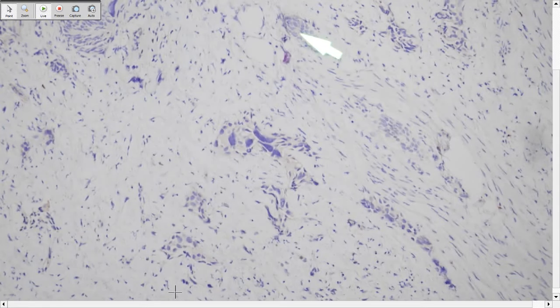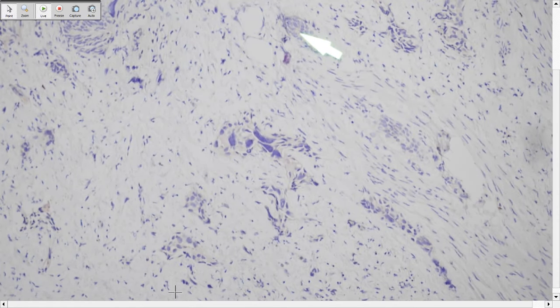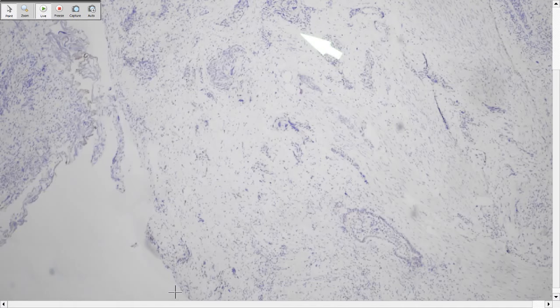So we just say high-grade CIS and this invasive high-grade urothelial carcinoma. CIS with high grade. No, we should call it high-grade urothelial carcinoma arising from CIS. Oh, okay. This should be called high-grade urothelial carcinoma arising from flat urothelial carcinoma in situ. Okay, and also describe the immuno and then support the urothelial origin. And it's invasive too, right? Yeah, this is invasive.